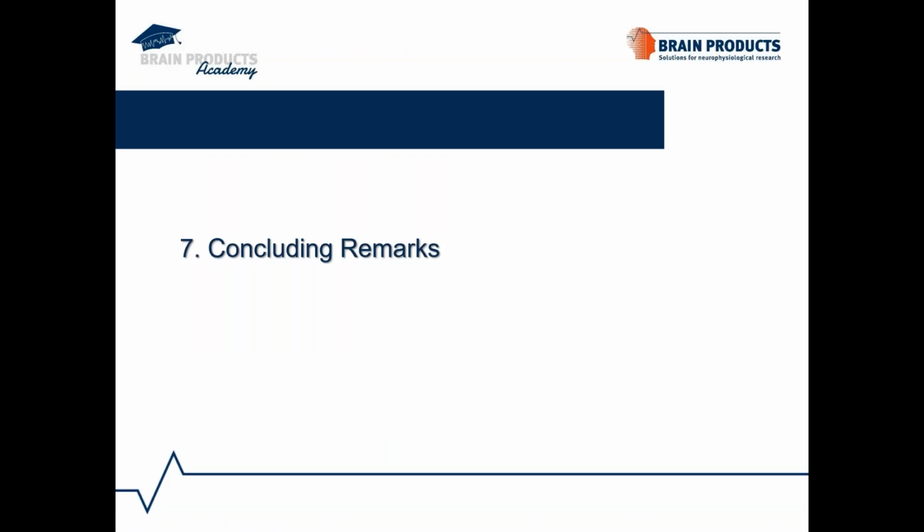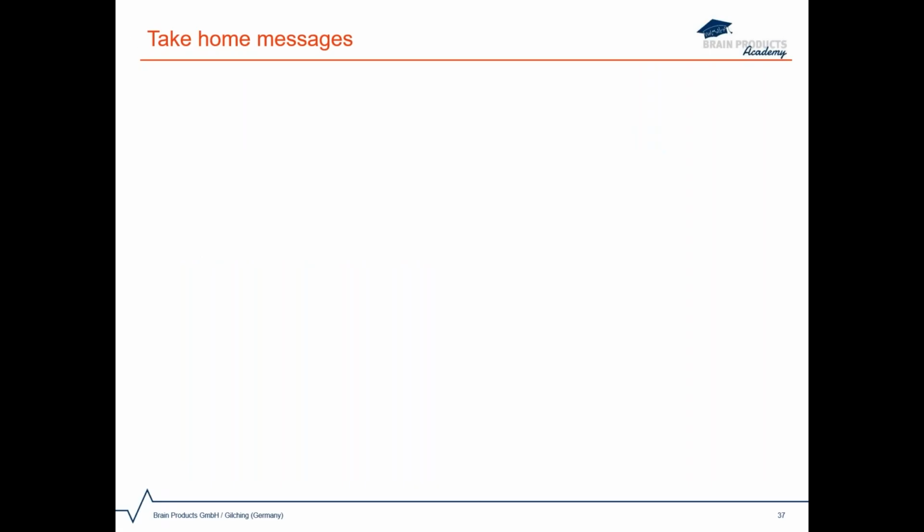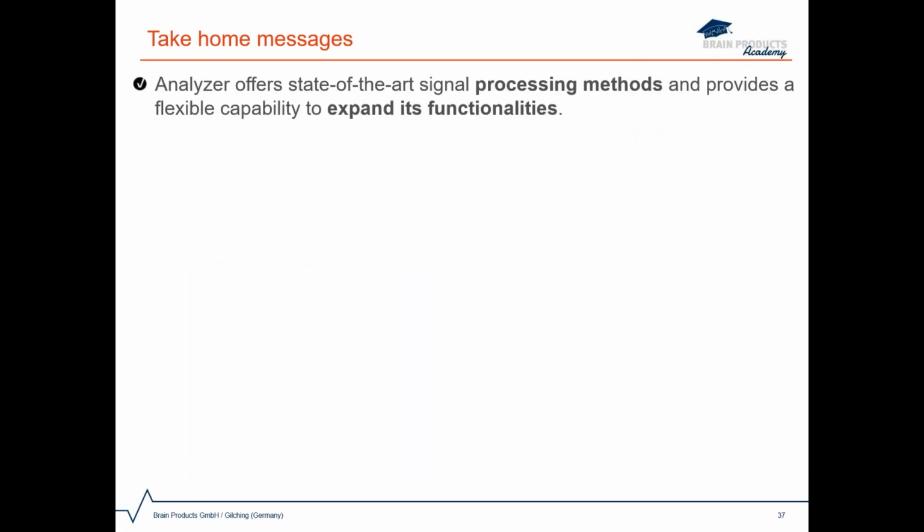Now it's time to conclude my presentation today. The important take-home messages are the following. Analyzer offers state-of-the-art signal processing methods and provides a flexible capability to expand its functionalities via macros or solutions, add-ins, and the Matlab transformation.